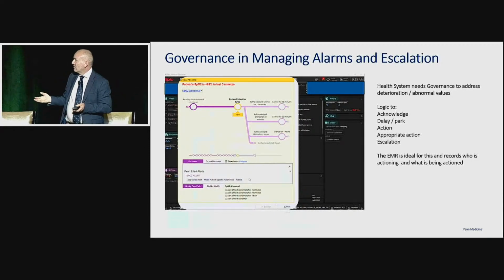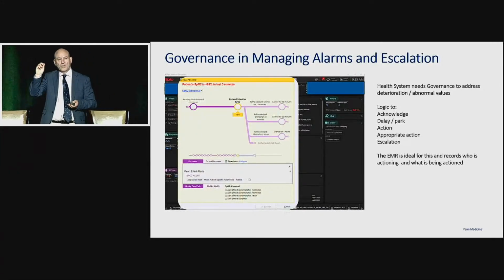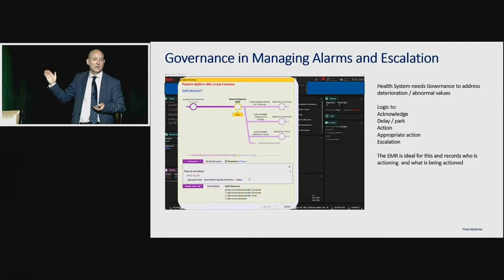But the thing I'm most proud of is actually governance. And that's the thing I learned in the UK, is if you don't have governance in your health system, everything falls apart, from quality to safety, everything. And so I think you're aware in Epic you have to validate alarms. The bedside nurses get overwhelmed with this. But we use unvalidated data. So it just comes through to us. And our data is not just firing on absolute values, it's also on deltas and trends.